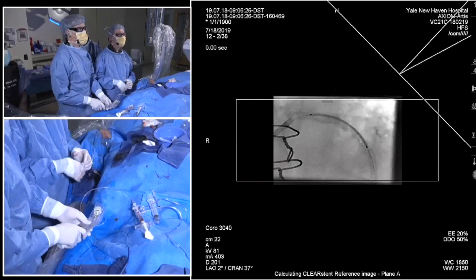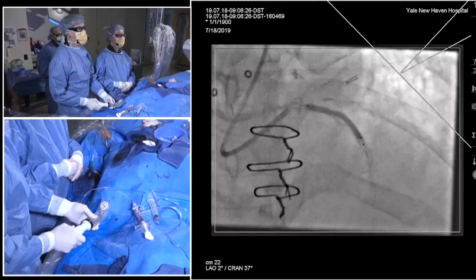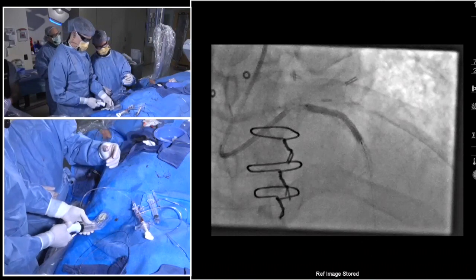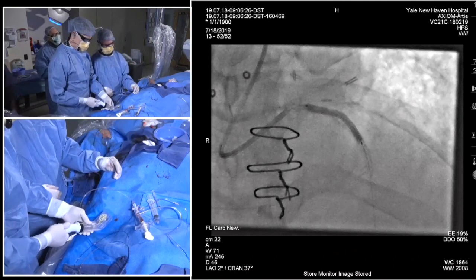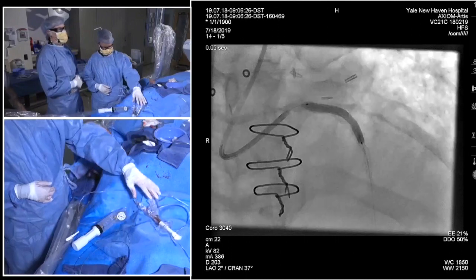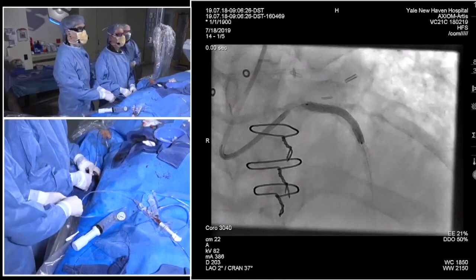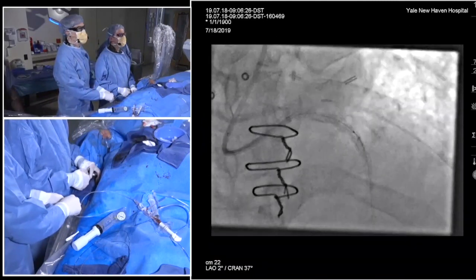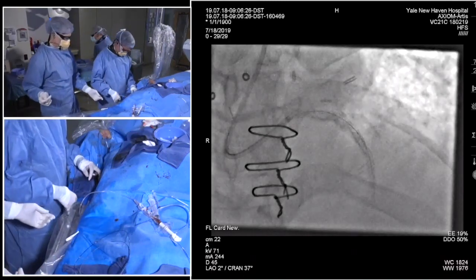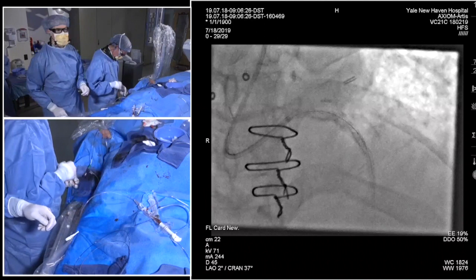It's a little bit difficult visualizing where the stent ends in this. We just did an IC stent, and I think we're overlapped enough. This is a 3.0 by 38, and then we'll have to put one additional stent in the left main. One thing you can do sometimes is that if the 3.5 expansion criteria are greater than the 3.0, you can under-deploy a 3.5 and then really flare the proximal more. But if you're going to put another stent in the main, that's okay. You may not need it, though. With the Synergy, the 3.5 and the 3.0 both go to 4.25, so I think you're going to have plenty of room with the 3.0.